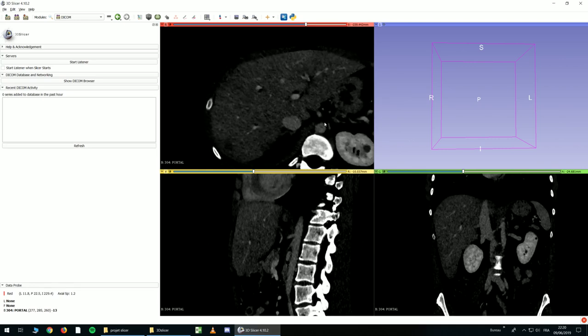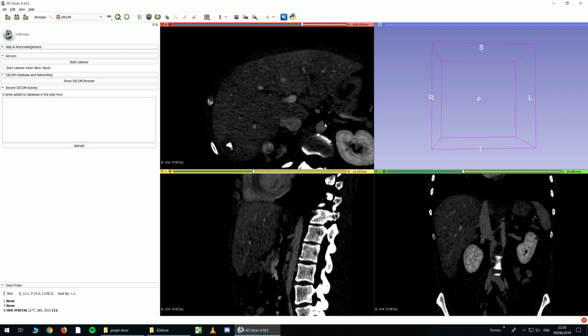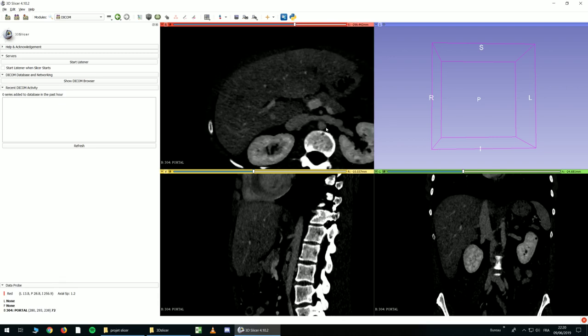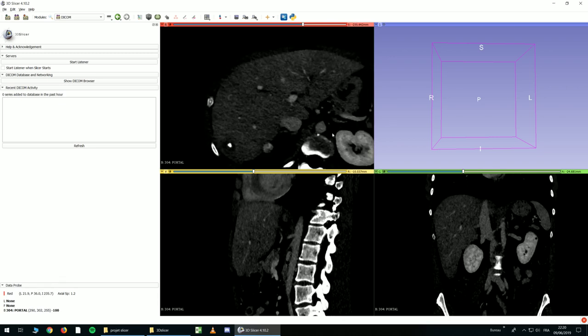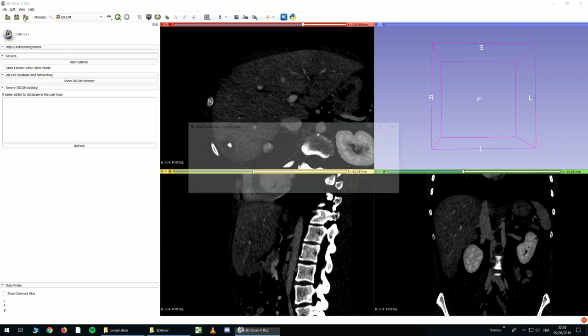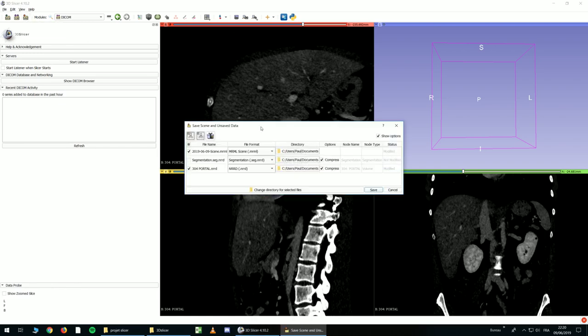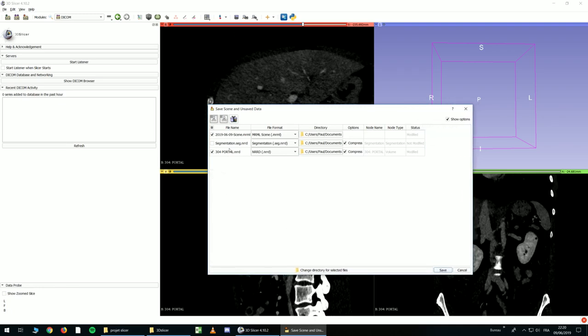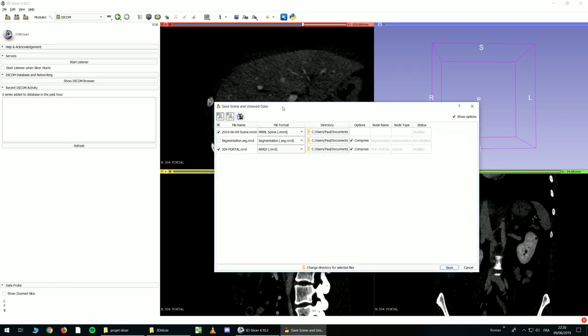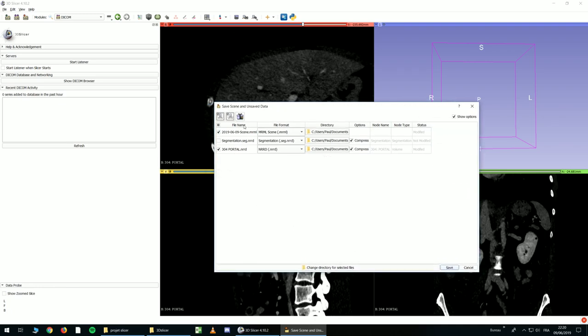And now, maybe it's time to save what you did, even if we didn't do anything this time. So you click Save button, and you will have this box. I recommend to use this button, it's Medical Record Bundle.